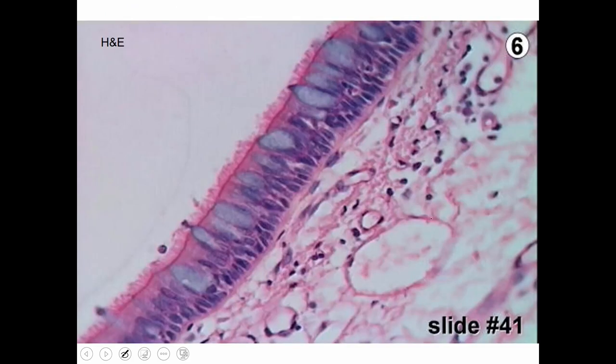So here, you can appreciate, again, when you look at a histological section, you would say, oh, I have a lumen out here. And so that means I have a surface of epithelial tissue. That's the apical surface. This is the basal surface down here. And we're going to talk about these terms when we get into epithelial tissue in a second. And you see you have your nuclei that are quite evident, very basophilic. And then we have these areas here, these granules. Would you say they're staining eosinophilic, basophilic, or fairly neutral? What would you want to say? Well, to me, if this is basophilic and this is eosinophilic, they look fairly neutral. They're really not picking up the stain as readily as the other components.